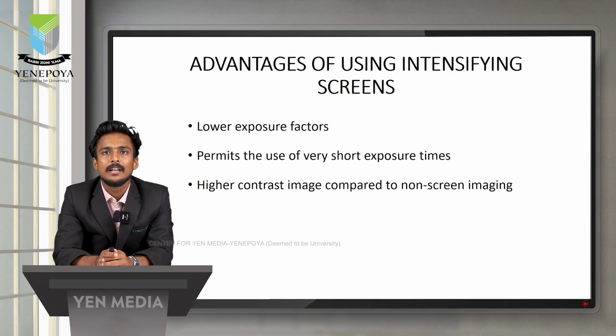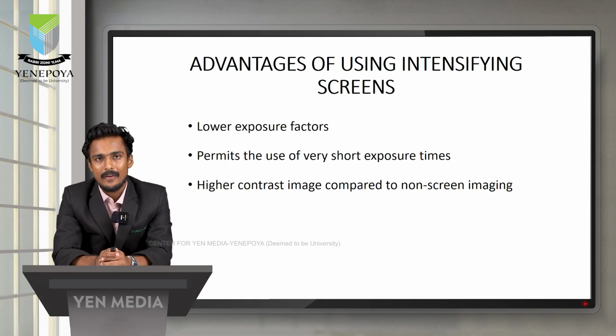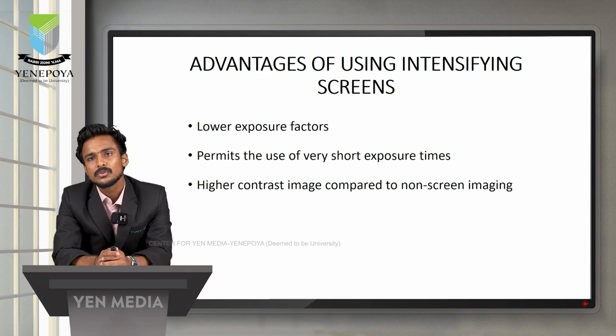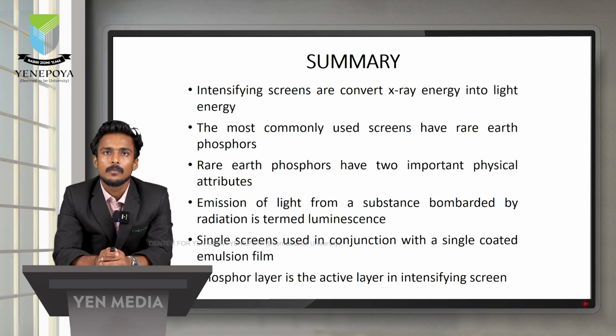Advantages of using an intensifying screen. When we use an intensifying screen, it reduces the exposure factor, permits the use of very short exposure times, and allows a higher contrast image compared to non-screen imaging. Moving to summarize the whole topic.